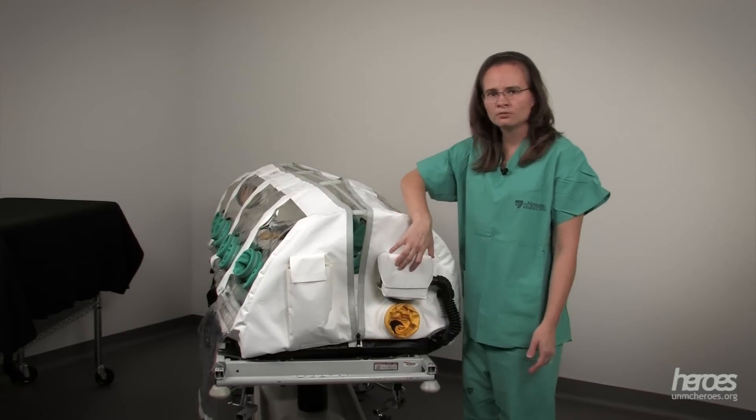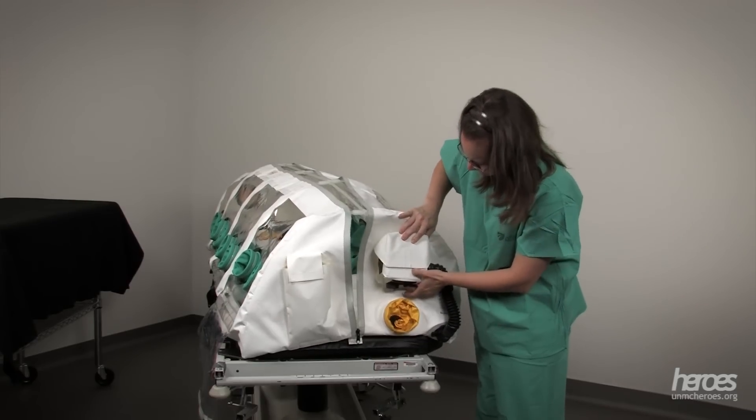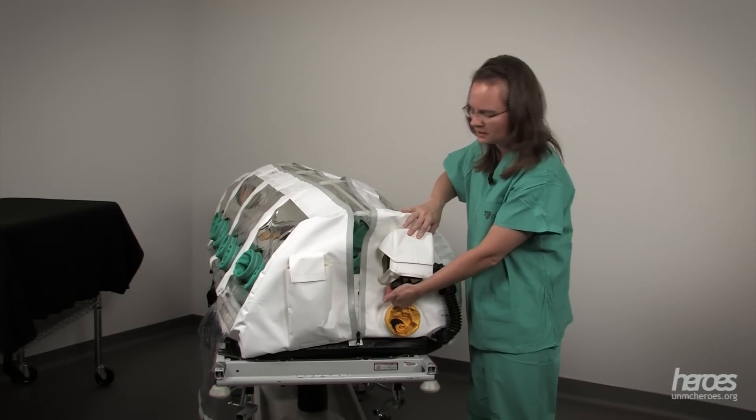The blower motor will beep when you first turn it on, and then you'll feel air coming out the bottom of the blower unit.